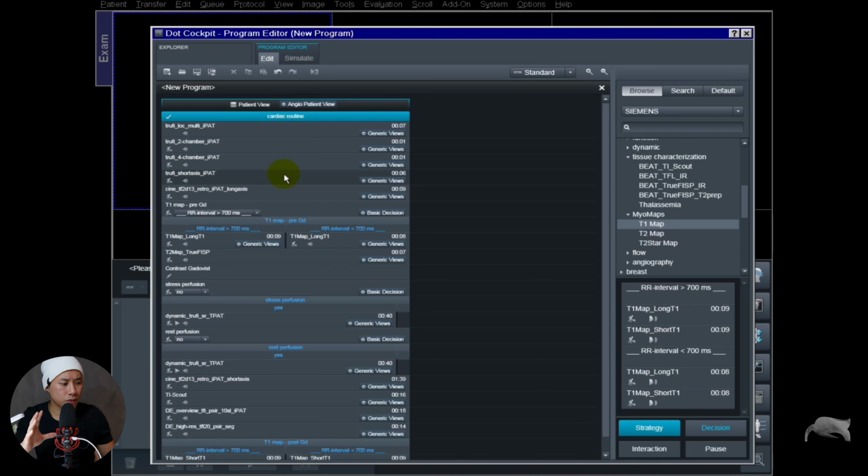The last thing I want to do now is to have everything copied to the master. Okay, you have a lot of slaves, and then you have one master. That's the shimming. The shimming is important. So the 2 chamber is the first sequence you open up, and whenever you finish with the shimming there, everything below will be copying to that shimming. Okay, so this is what I'm doing now.